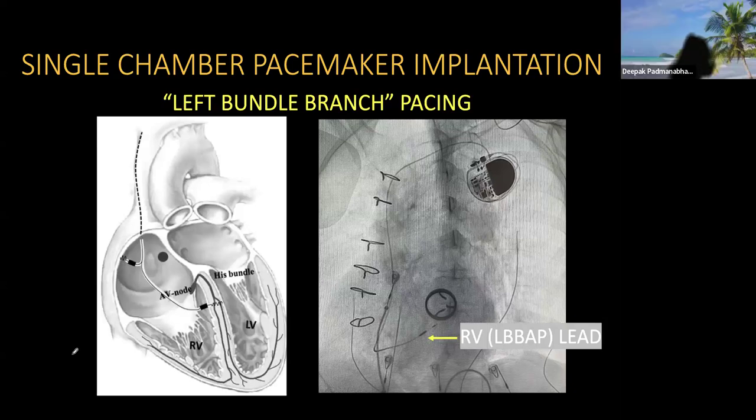No, I agree with you. I think given the challenges with pacing-induced cardiomyopathy, especially in a substrate that is already diseased, it will be incredibly important for you to get left bundle capture, at least in a non-selective manner, if not in a selective manner, for these cases.